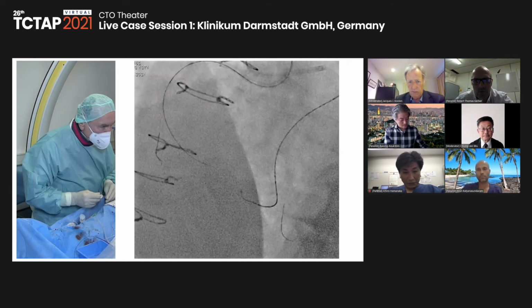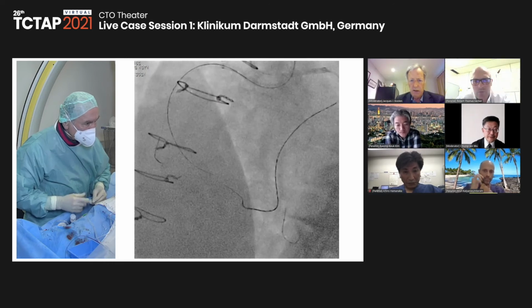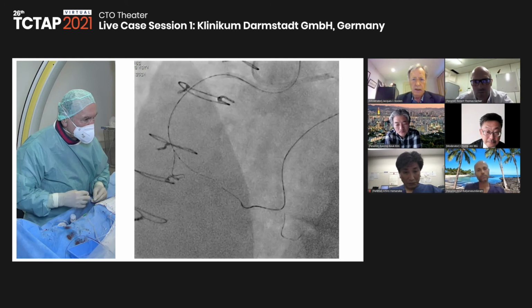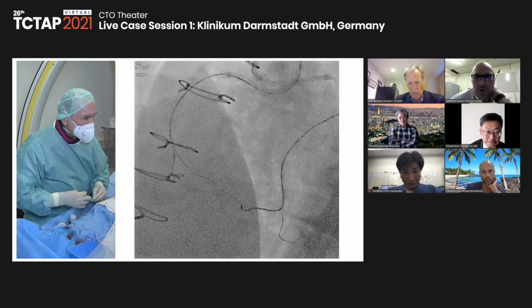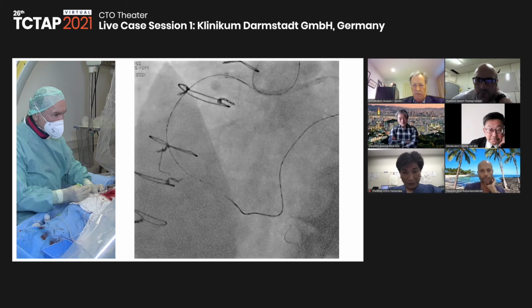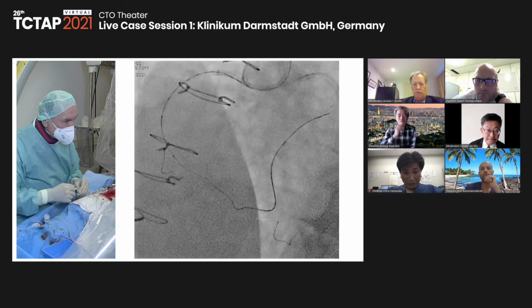So here's the Ultimate, going into the DL. Yeah, okay. That's nice. Some more advancement, if you can. Yeah, but it's not good enough yet. A dual lumen catheter would be useful here as well. Yeah, but I'm not sure whether I will be able to get through. Now you see the Caravel advances. Nice, very nice. Now I would even feel confident to go to a Gaia 3.